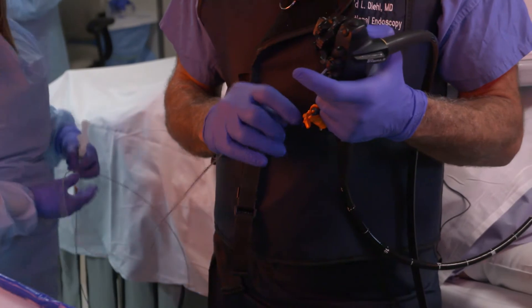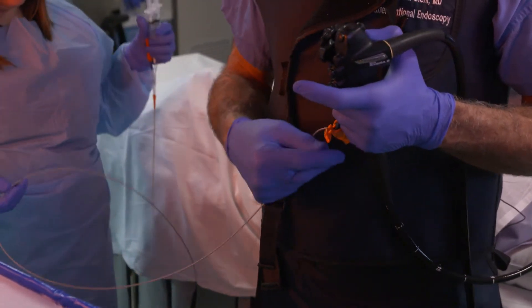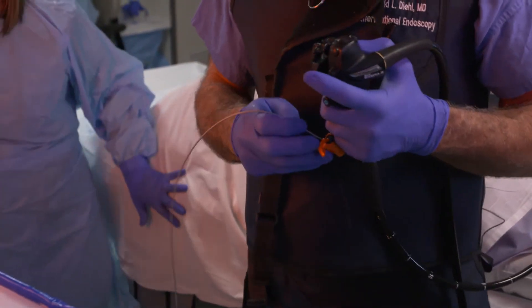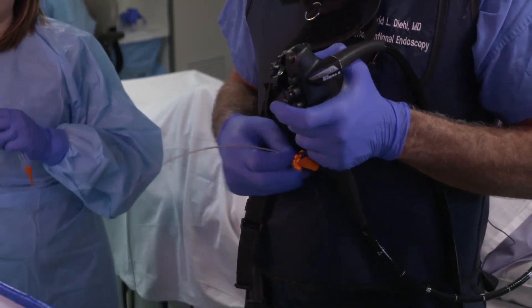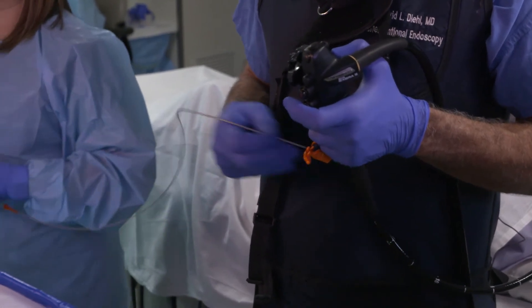This is a multi-sized balloon — the Quattro balloon. We look at the duct size; it's about six or seven millimeters. So I'll ask Nicole to use the smallest size to inflate.